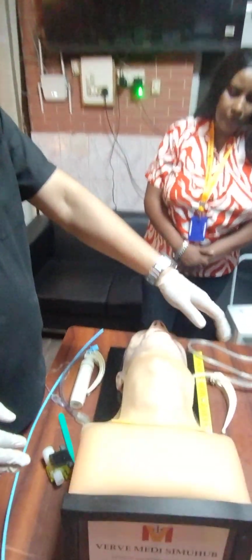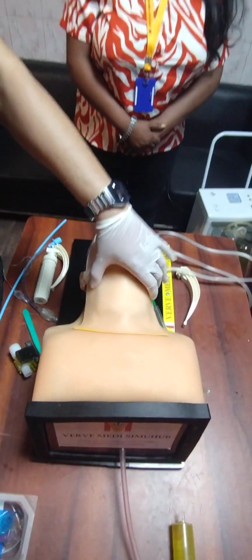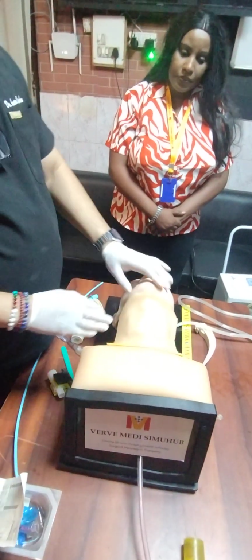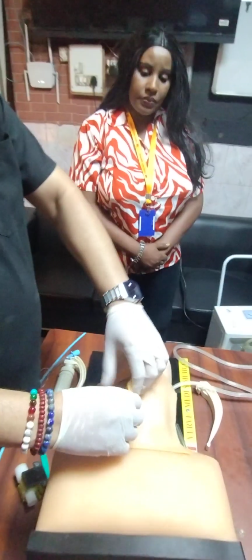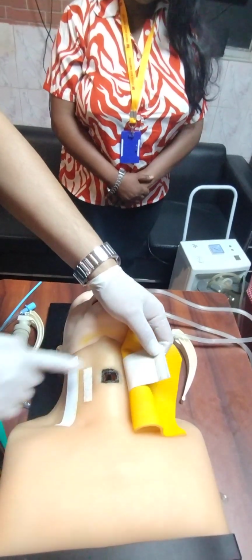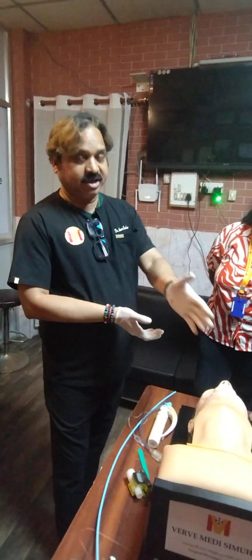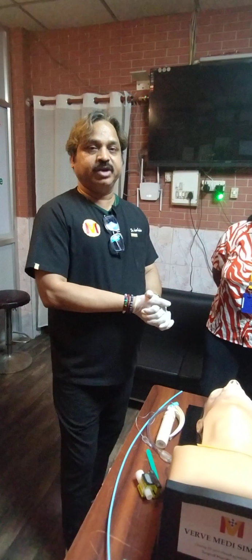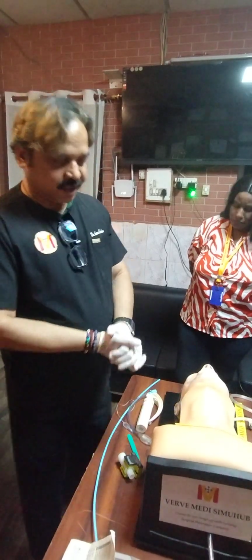So what we have done, we have fixed the TM joint, and most of its movement, the neck, is restricted. And apart from difficult intubation, we have also given the facility for surgical cric. So both skills are incorporated in a single mannequin. So this is the larynx, and this is the membrane. So after failed intubation, like you have taken 3 attempts and you are still not able to intubate, immediately, maybe before that, the person doing the intubation, even after the first attempt, can decide to go for a surgical cric or an eFONA.